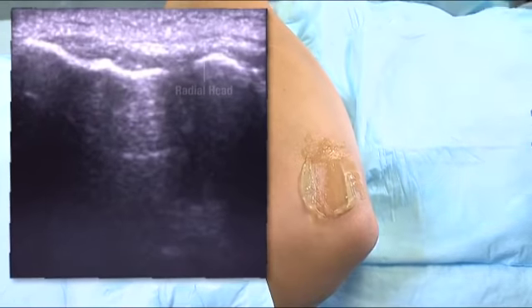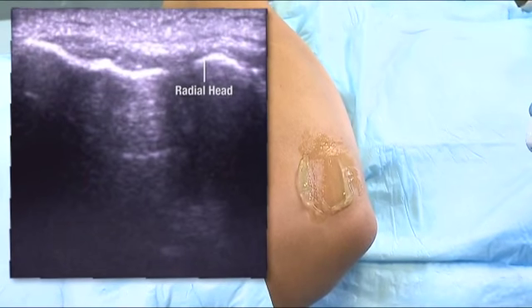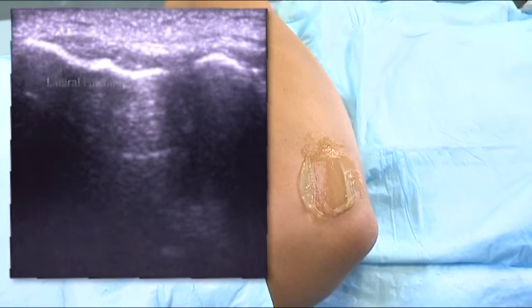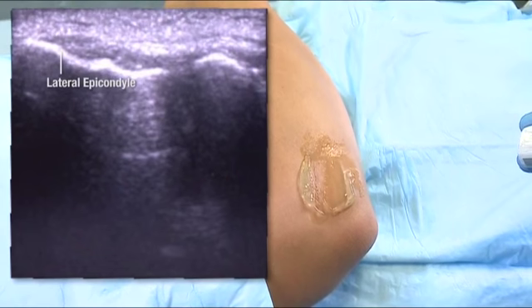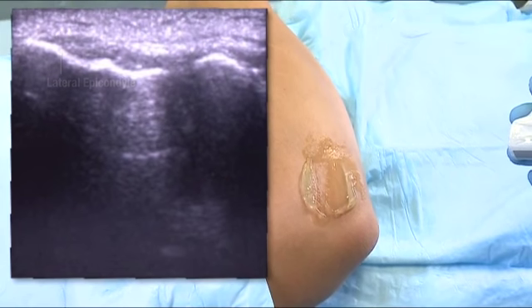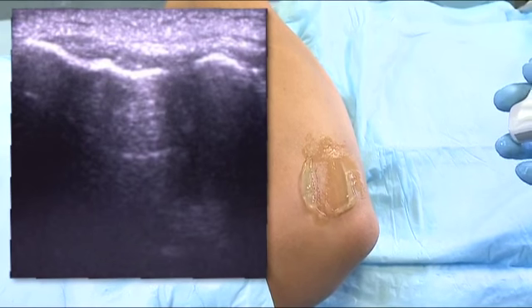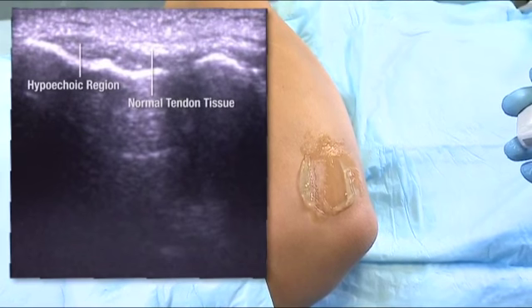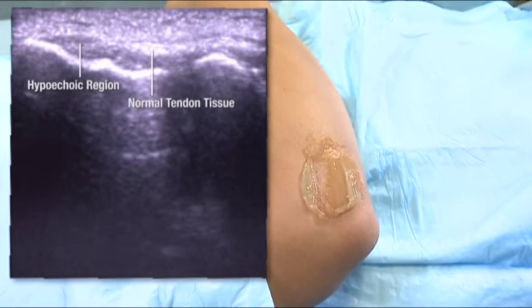On the right side of the screen you see the radial head, you see the joint space, and then on the left side of the screen the bony landmark in a hyperechoic fashion — you see the lateral epicondyle. At the crest of the epicondyle you can see some regions of disease as demonstrated by a hypoechoic focal area, and you have thinning of the tendon tissue.